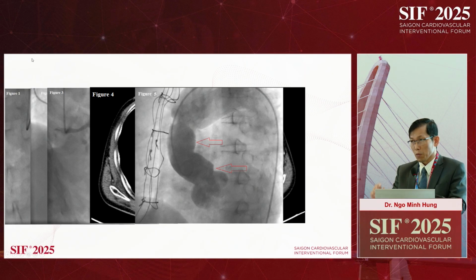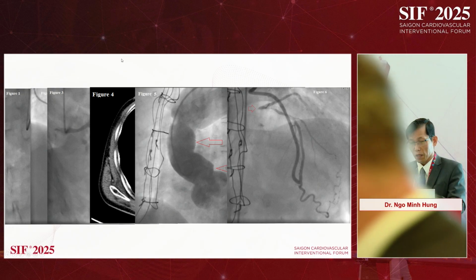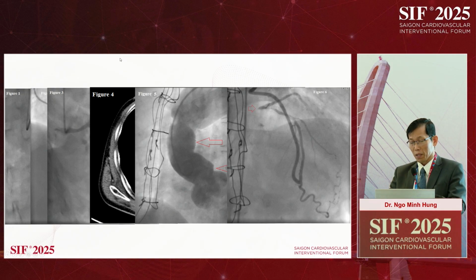So you preserve the left main, but 1 year later the left main disappeared, and now we do the picture on this side. We don't see the left main, but we still have the RCA. This is very tough for us, and we did the angiography from the LIMA with strong injection. We can look at the distal left main there and the circumflex.